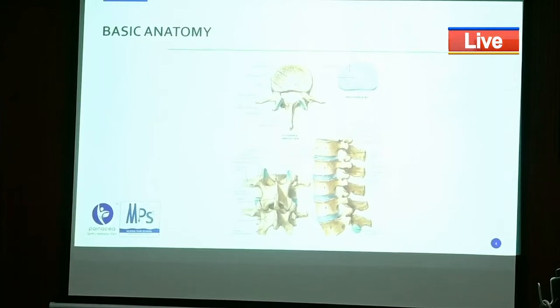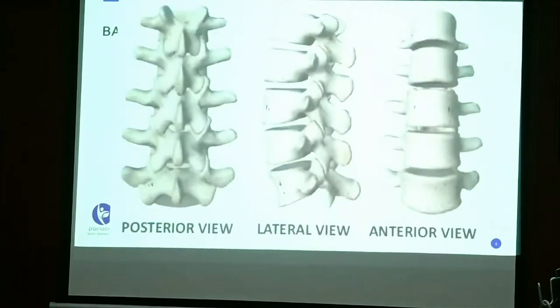So this is why we always remember the SAP, that is the SAP. Okay. So this picture shows three different views of the spine. This anterior view we are almost never going to see, but why I put this is because in the X-ray it looks like this. Okay.